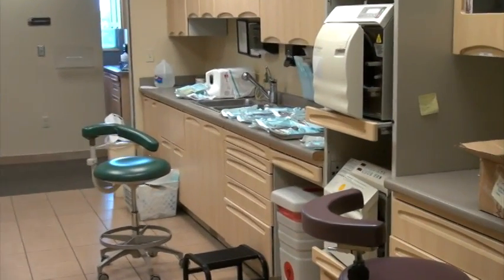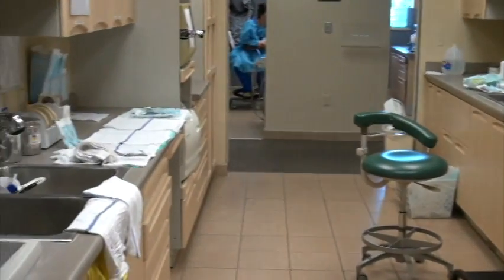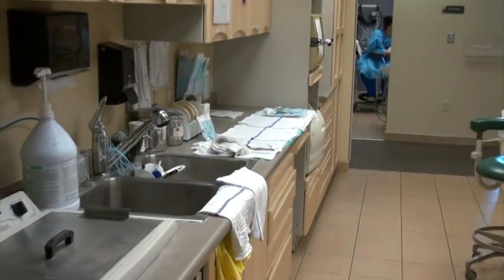What we do here is once we're done with the patient, we bring the dirty instruments over. Everything is completely scrubbed clean in an ultrasonic machine, then dried up, rebagged, sterilized, basically baked so they get so hot that everything is cooked off. And then they're replaced in the room so that they can be reused on patients.